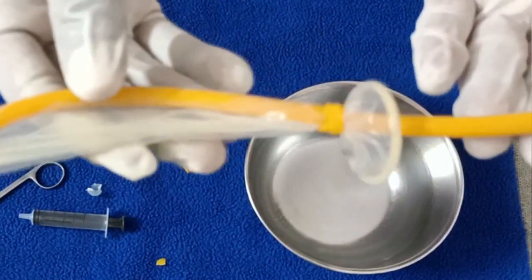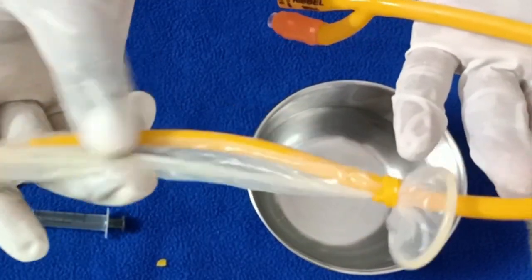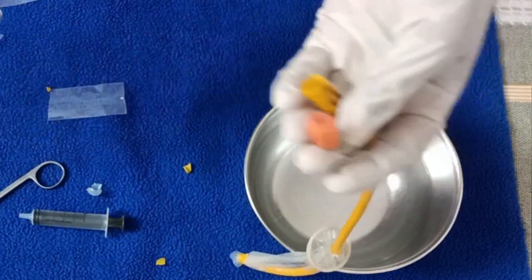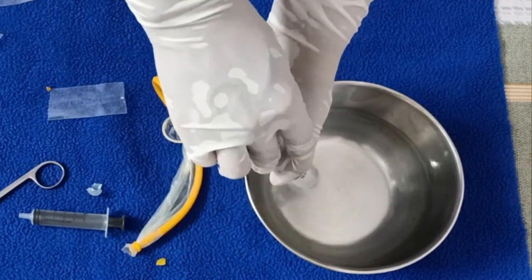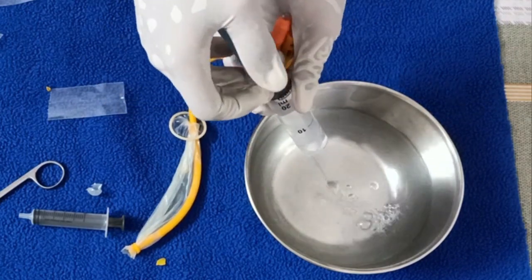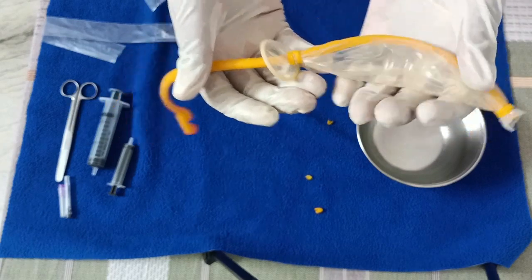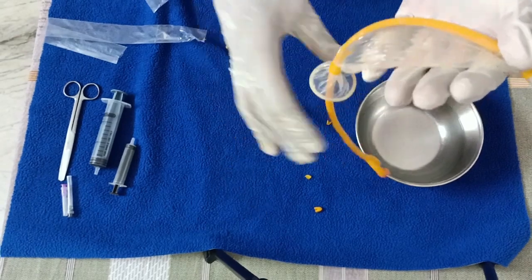The balloon is now ready to be used. Now we check the balloon by putting some NS through the inflating port using a 20cc syringe. After filling it with NS, I check both ends to ensure there is no leakage — and there is no leakage even on inflating.